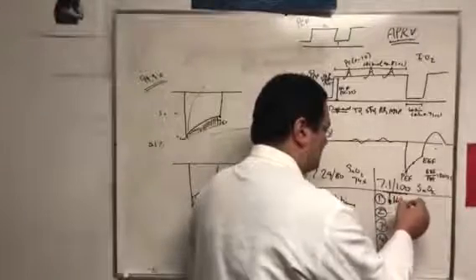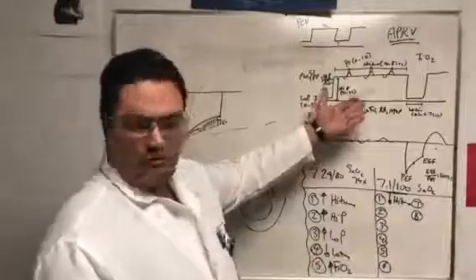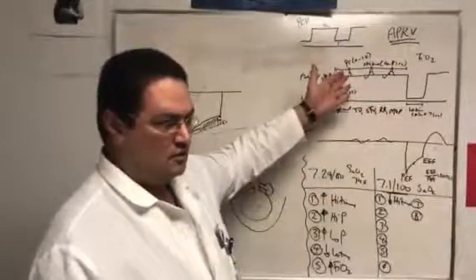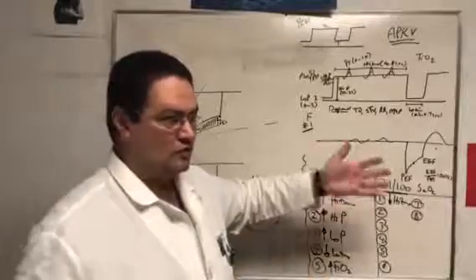So basically, if you decrease the high time, you're allowing. What is the respiratory rate in this mode? Did we mention respiratory rate? There's no respiratory rate. So that's the respiratory rate. You decrease the high time, and then it changes more frequently.